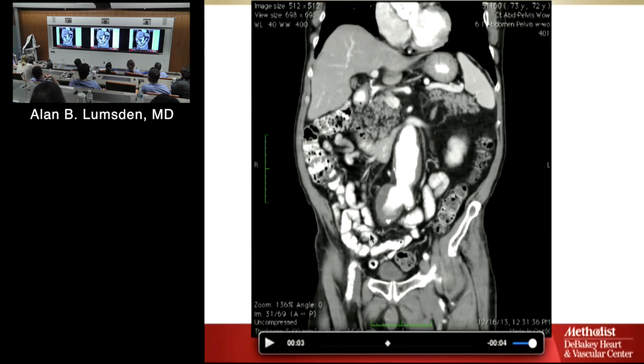SMA. End on the SMA. What's this nasty looking thing? Right femoral. Right common femoral. Calcified vein. So what's that? Saphenous. There's the saphenofemoral junction. All kind of laid out there for you.